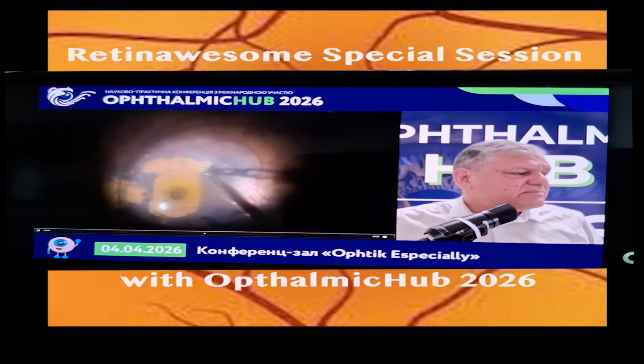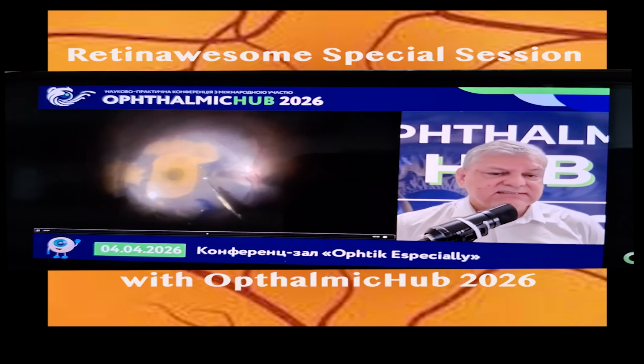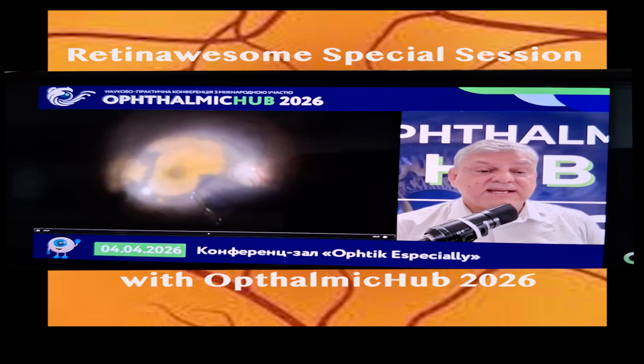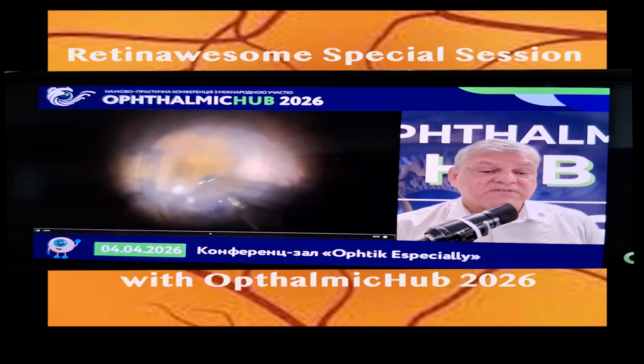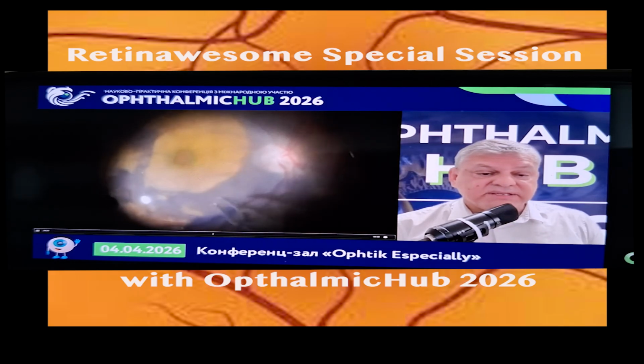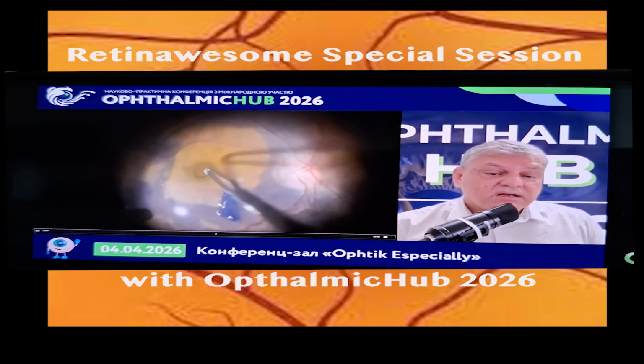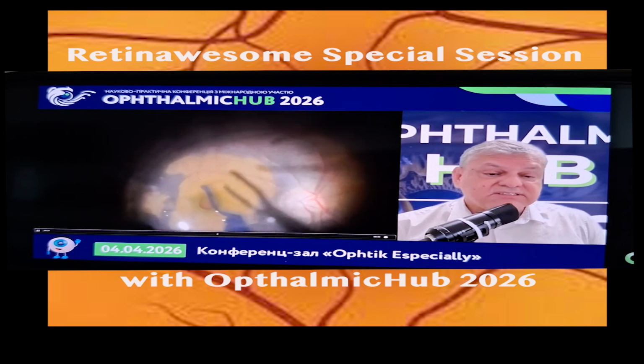By completing the peel the most circular possible around the macular hole, very slowly and engaging the ILM with care, and you have the fluorocarbon liquid that helps you have a better control of your peel.